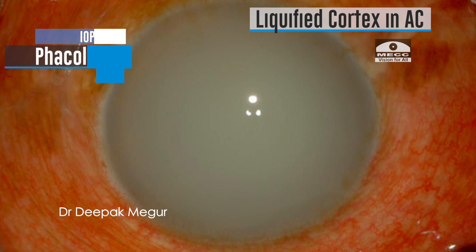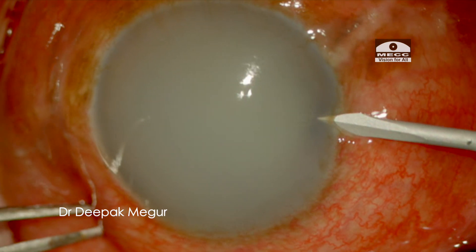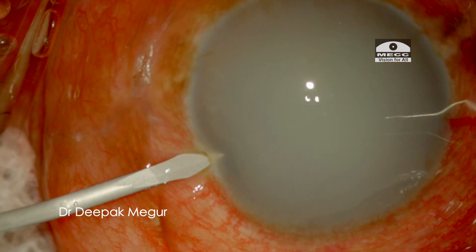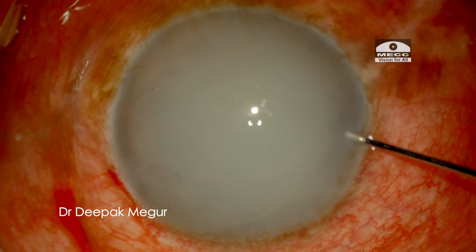After the initial anti-glaucoma and anti-inflammatory therapy, the patient was taken up for surgery. I make a side port incision and irrigate the chamber, and all the lens matter in the chamber could easily be washed off.